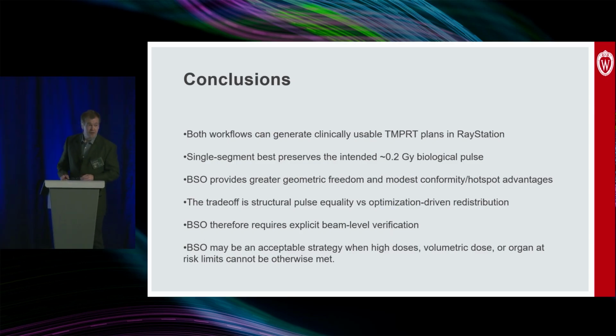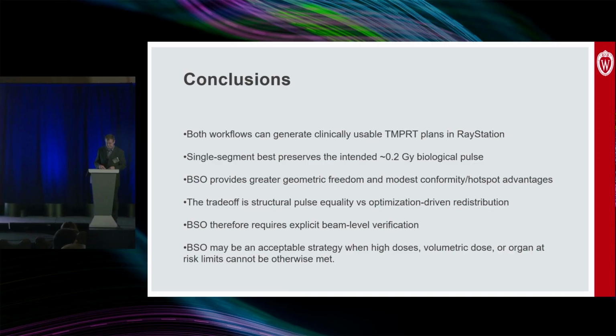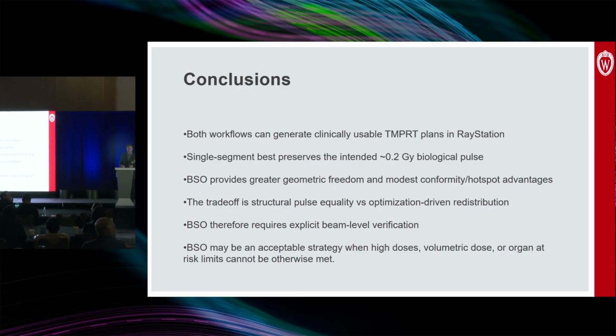Thanks, Adam. Great presentation. I have a question, actually. Wolfgang and I talked about this back in December, and his question was whether anything had to be changed in the physics parameters in RayStation, or whether the beam-specific objectives were sufficient. Do you have to do anything to make sure it's deliverable?